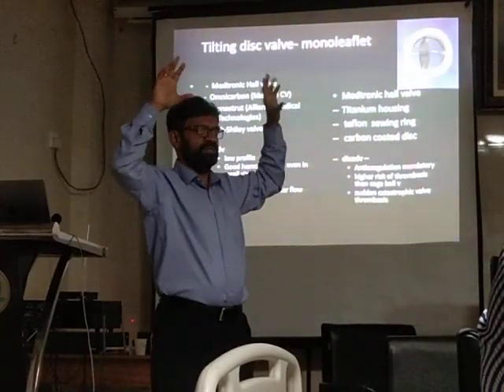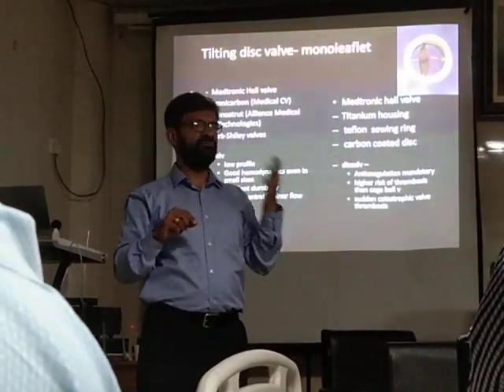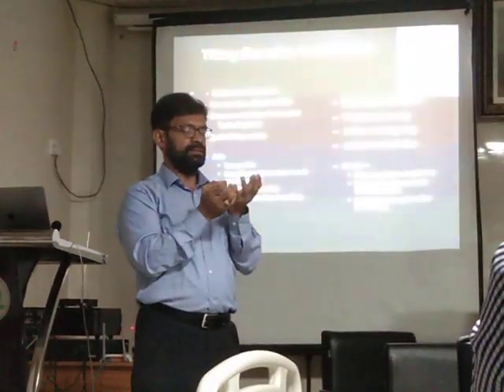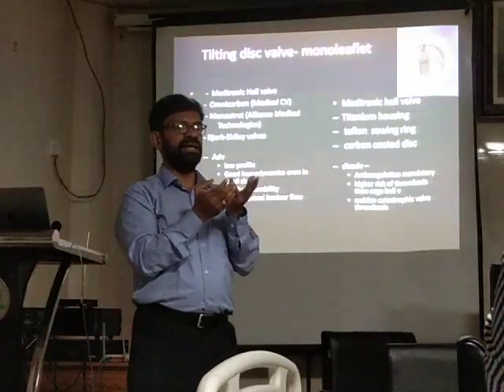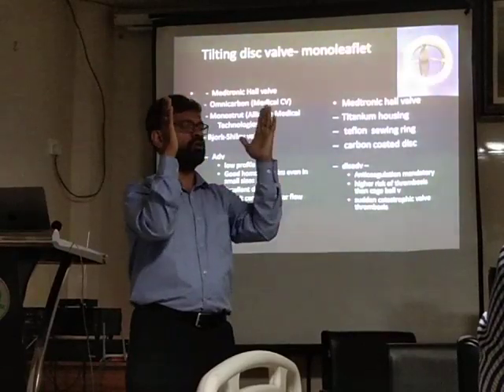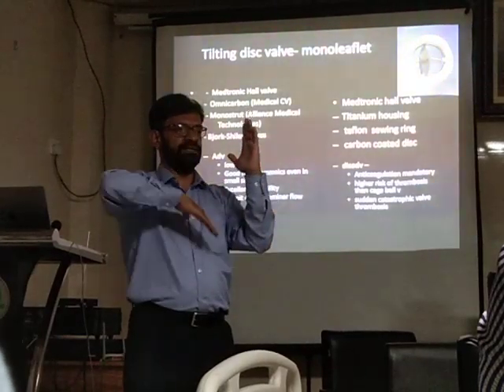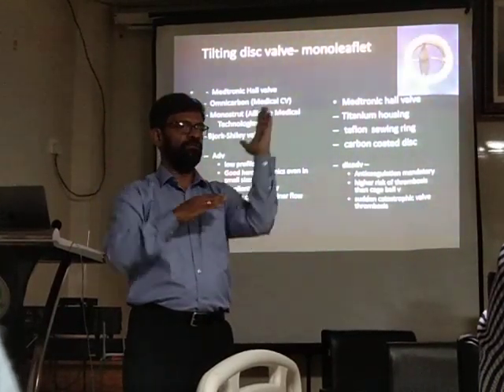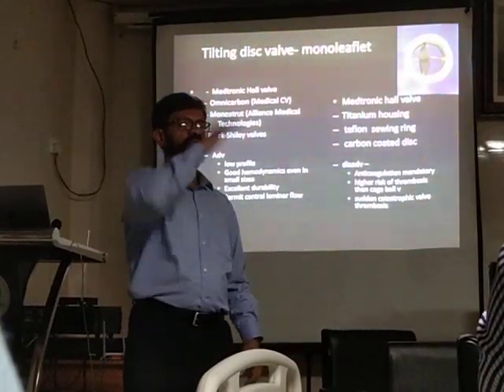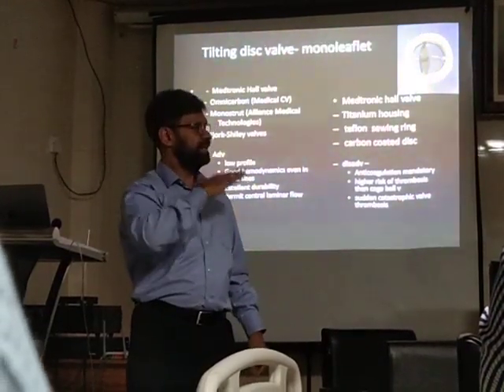Same central jet, partial. So whenever you are getting a discharge card or follow-up, there are a couple of things you should read. For the valve, there is the size. Second is, what is the angle of opening? Bileaflet is always 90 degrees. 90 degrees, it will be like this. One will be 90, the other will be 60. Single leaflet opening has to be 75-80-85. If it is going down to 30, again a problem.